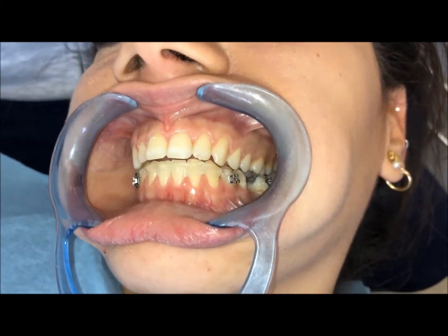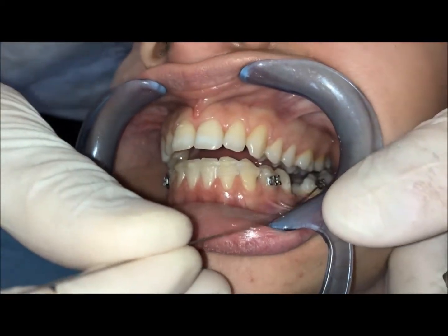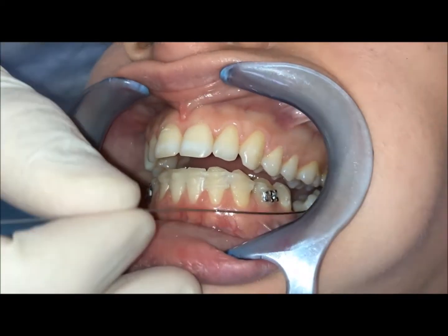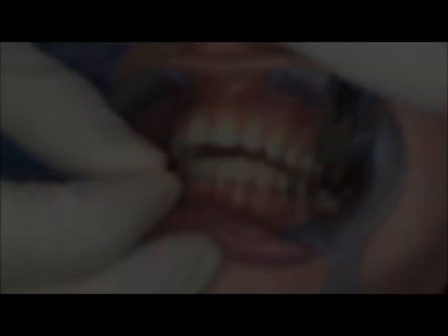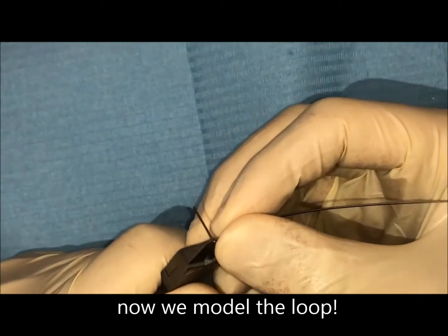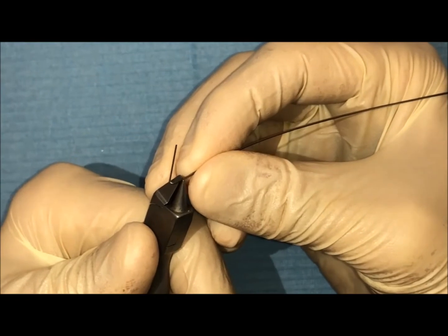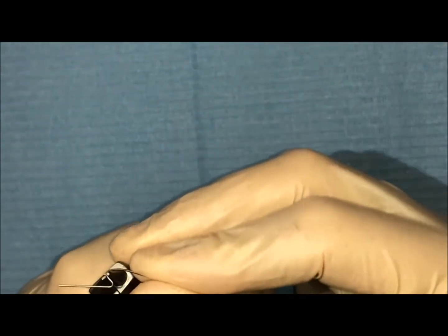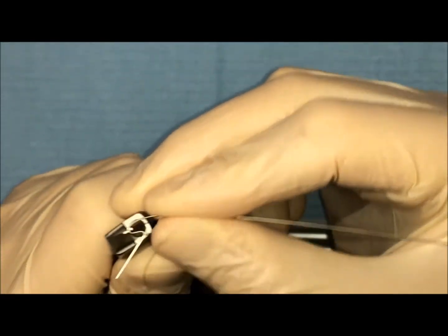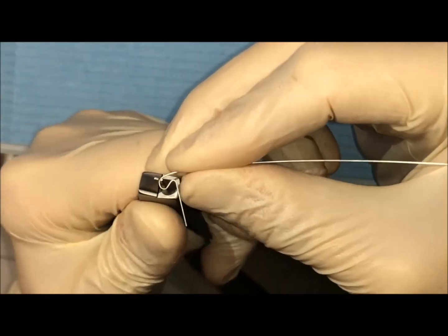We start with the wire. This is a 17 by 25 TMA wire. We do a loop exactly here, and we model it with a small loop. The loop has to be very small because we are very close to the gingiva. So we are modeling something like this.